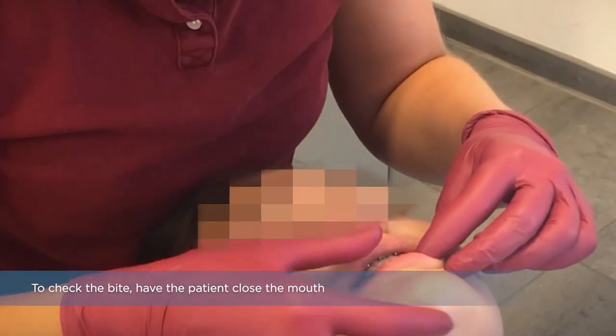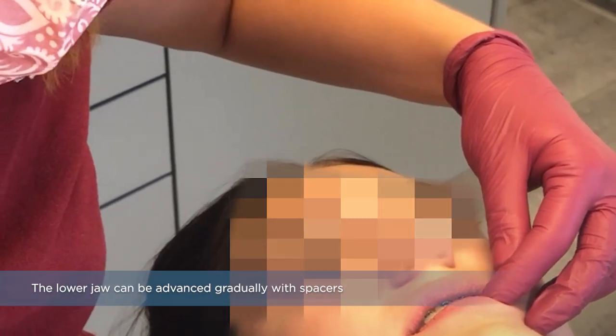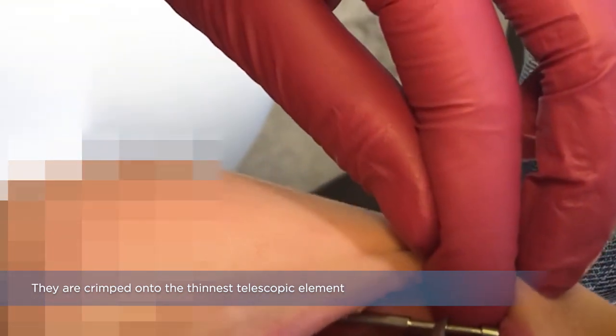To check the bite, have the patient close the mouth. Make sure that the telescopes are completely closed. The lower jaw can be advanced gradually with spacers — they are crimped onto the thinnest telescopic element.